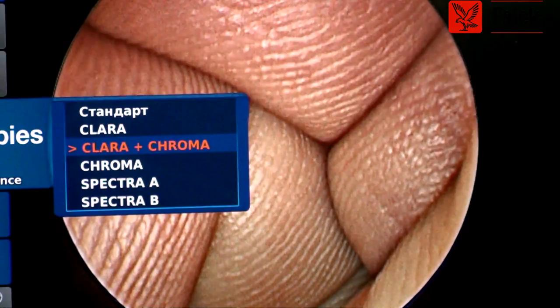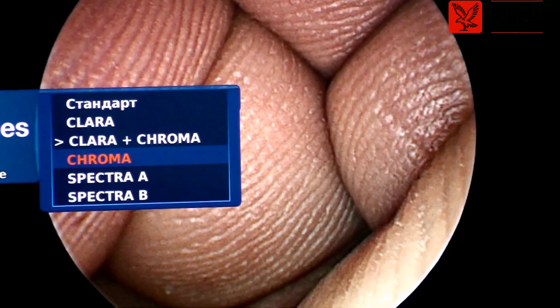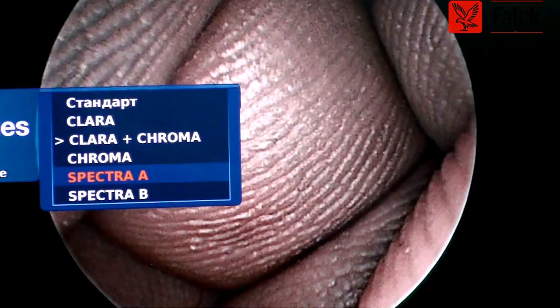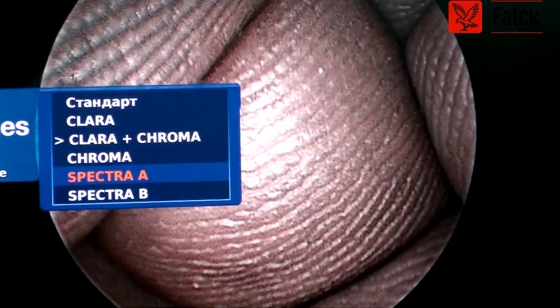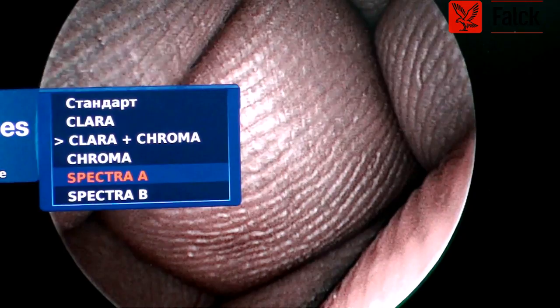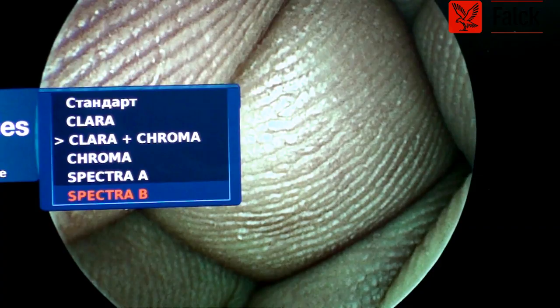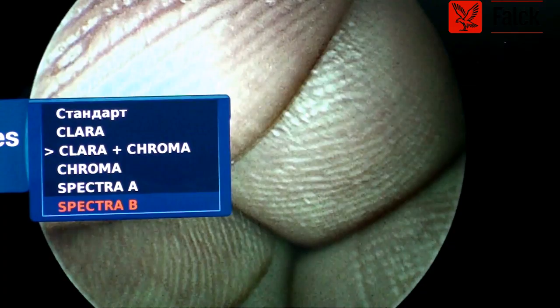This is the Clara plus Chroma. Then you have just Chroma — there is an enhancement of the red, which can be seen better in the nose or into the larynx. Then you have Spectra A and Spectra B. With Spectra A, the vessel becomes blue or a blue-green color, so changes in blood supply into the mucosa of the nose, oral cavity, or pharynx can be enhanced. With Spectra B, there is a more orange spectrum, and again into the mucosa, it enhances the vascular supply. I should put this probably into my mouth to demonstrate, but we will use it on patients.